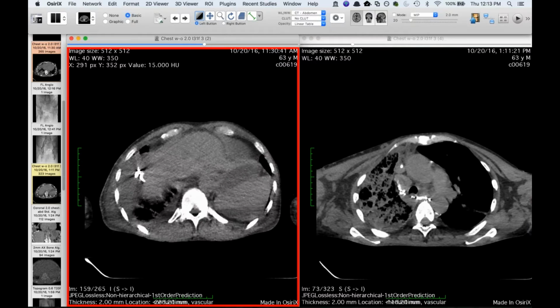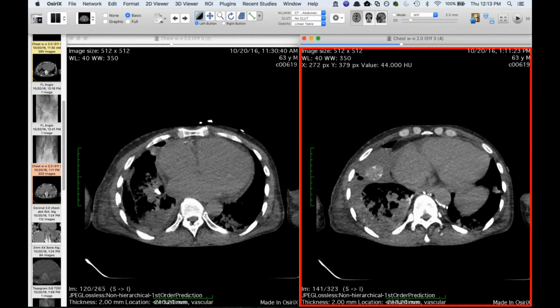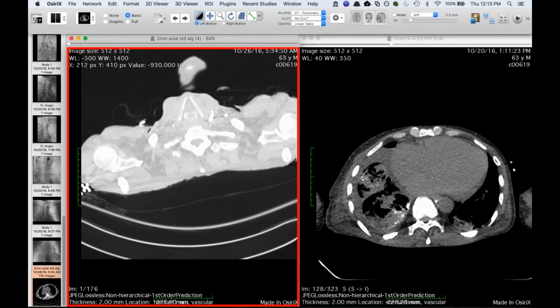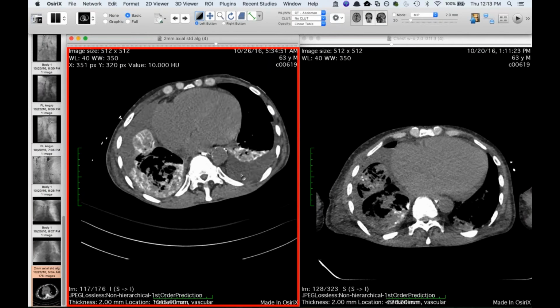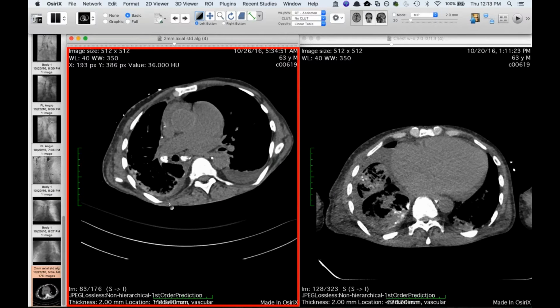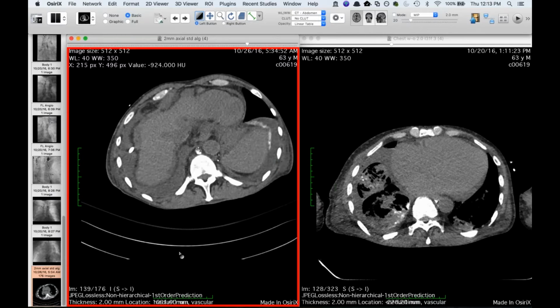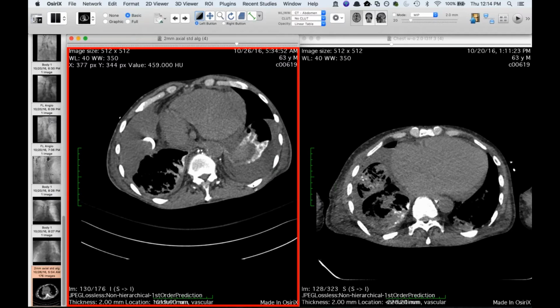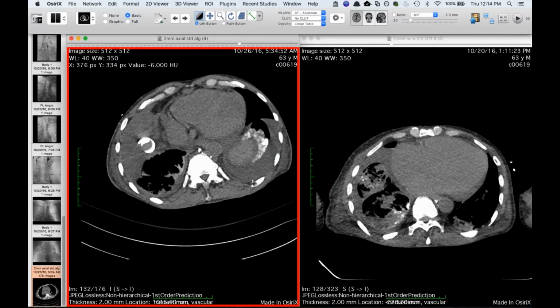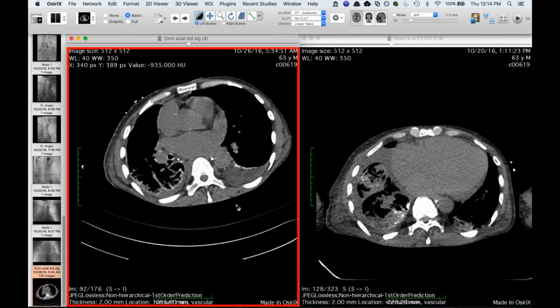And nothing on the left? No, just a little. There's a little bit of high attenuation that ended up, not at this time, but on the study that was done yesterday. Now you can see that there is a little bit on the left as well, but not nearly as much as there is on the right. And I was telling Howard that there are case reports of SVC syndrome causing chylous effusion. This patient had actually come to my attention back in the spring when he originally presented with the chylothorax, and we discussed that. But I just thought this was really interesting.